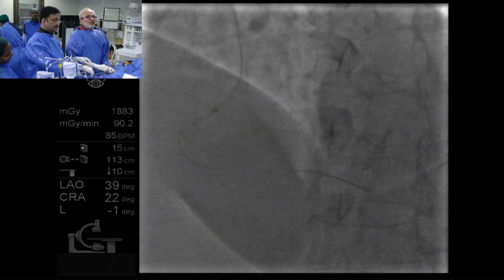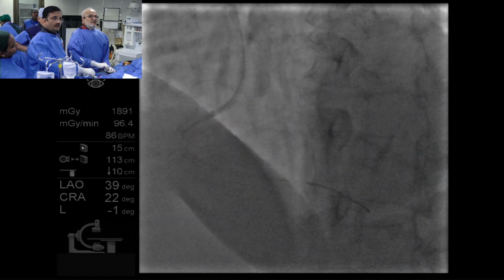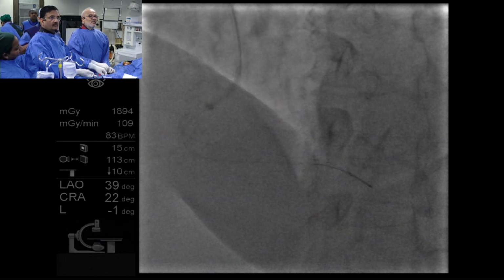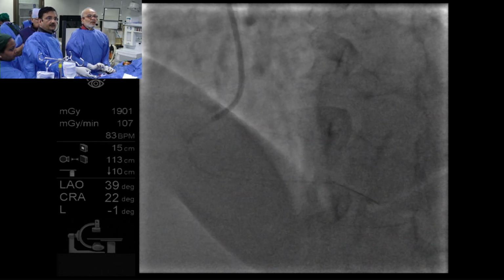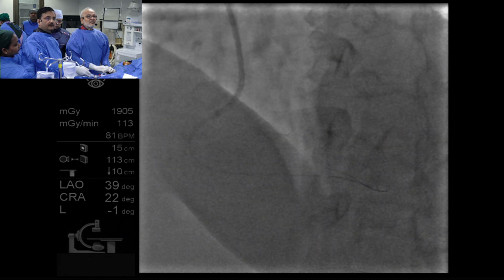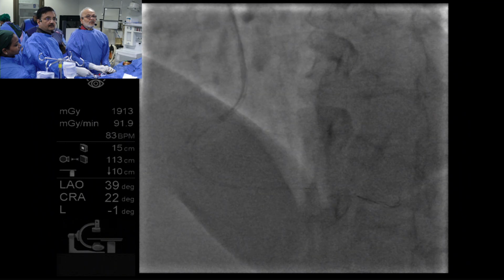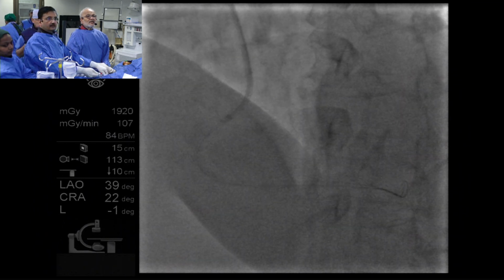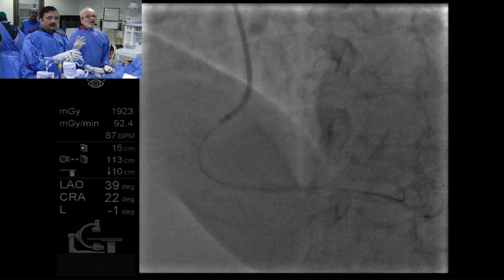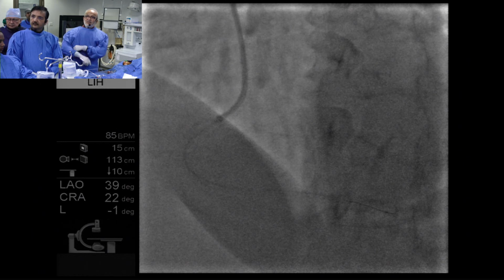In India, we have to think about the patient's pocket. So we have to carefully select our. Barabar hai? Julia, let's little more. Huh? Wire. Wire we have to. Yes. Yeah. No. Okay. Okay. Little more. Okay. I think so. Wire. Chalo, let us start. Yep.